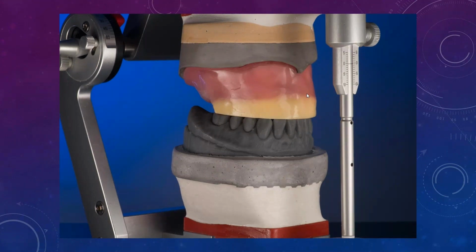So I try to stress this point to make sure you get everything properly fabricated in the tissue supported stage and not move forward until you have everything rounded out and your bite's stable with tissue supported. Don't move towards the implants, guys, because I see a lot of times we'll end up doing an immediate denture, and at the same time we'll use that immediate denture as a surgical guide, which is a valid protocol. Don't get me wrong, a lot of people are doing this, and I do it myself. But how often do you guys see a case where we had done an immediate full upper, full lower, and the bite has changed within the 2-week period after the surgery, and we need to change stuff around? I need to adjust the bite, or we need to redo a denture.